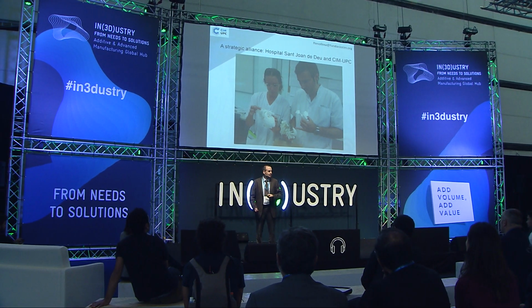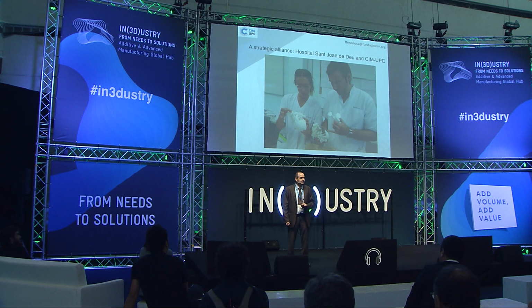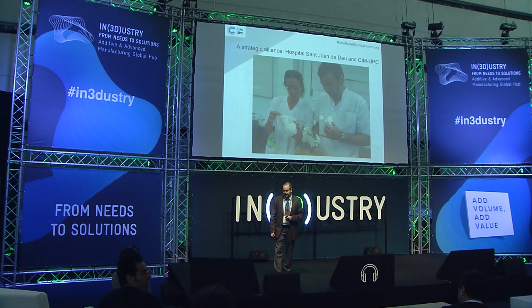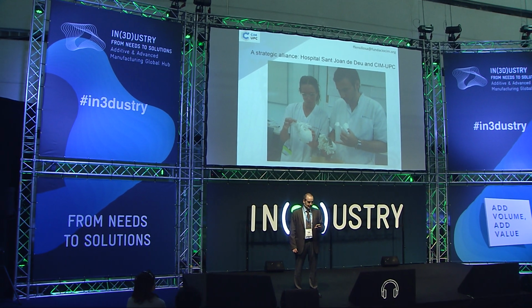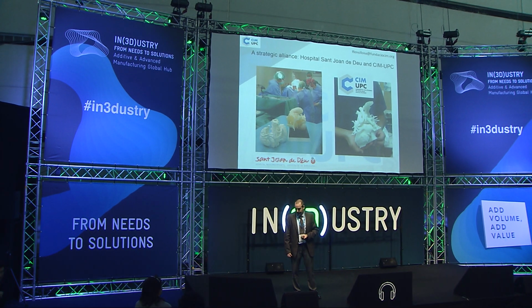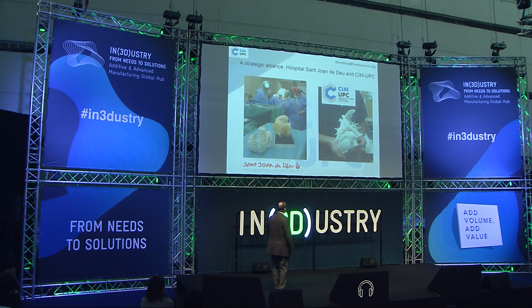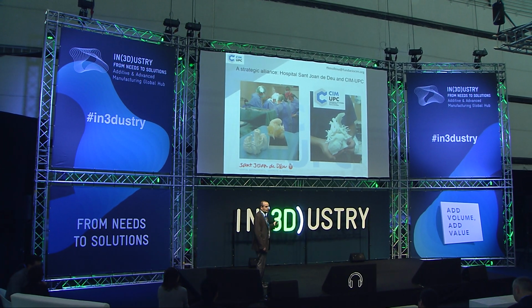What have we been doing over the last years about health and 3D printing? Arnau has told you things about that. More of the slides that Arnau has shown you is what I was going to tell, so I'm simplifying. Here you can see Dr. Lucas and Lucia, the radiologist, examining prototypes made in CIM-UPC and trying to decide what to do. This is the surgery room. This is a heart, with the tumor, but we print prototypes with the tumor and without the tumor in order to see perfectly the vessels affected by the infiltration of the tumor, for example.